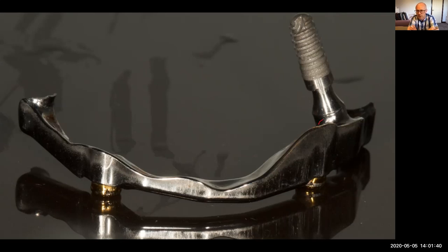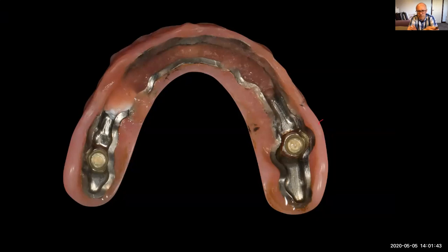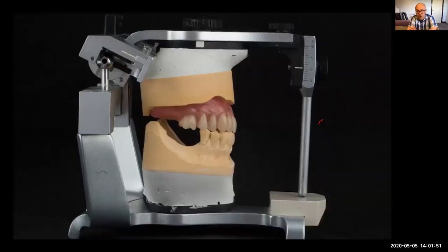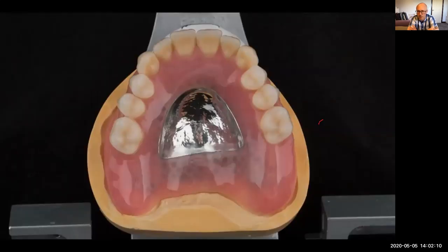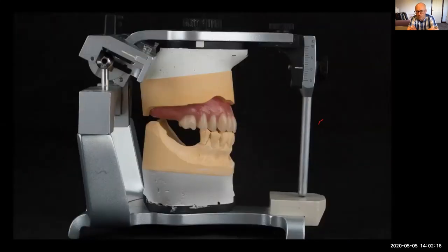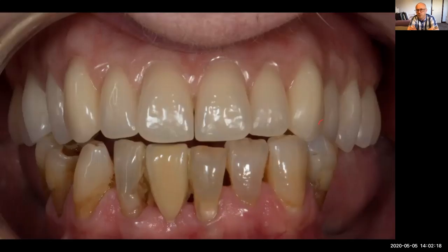So anyway, she comes in like this, and so I just relined that front section just for now. And then what we did was we made her a complete upper denture, metal based, and then put healing abutments on all of the cover screws on all of the rest of the implants. So effectively she's got a complete denture now, and that's her finished and done. And it's just future proof. It's so much better, and I feel so much more comfortable with her having this.